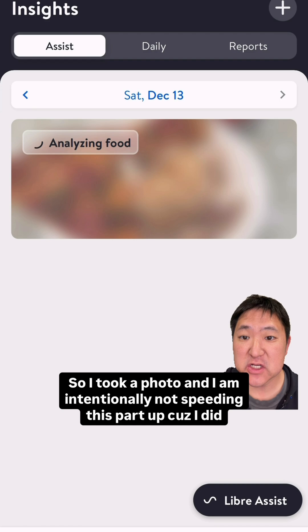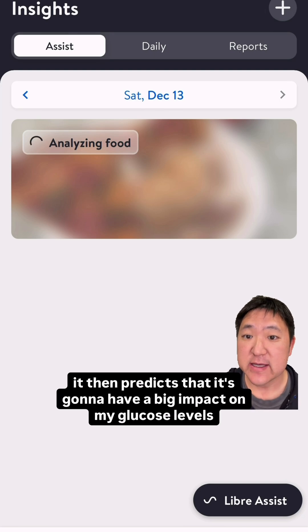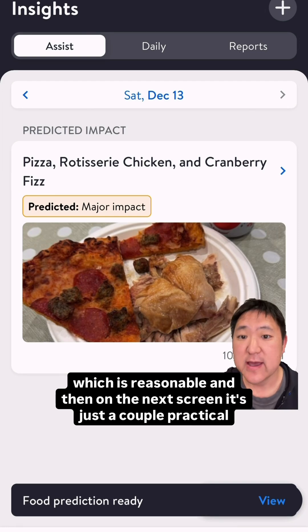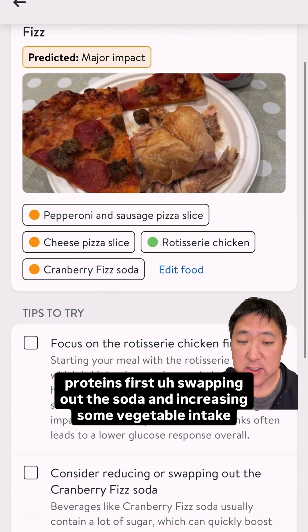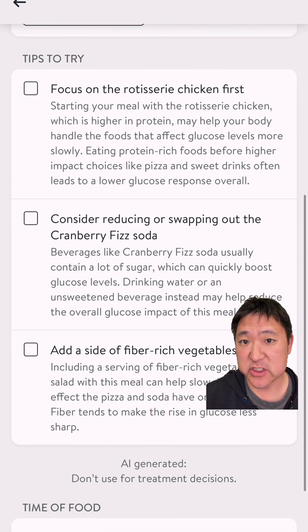I took a photo and I'm intentionally not speeding this part up because it did take a little bit longer than I would have liked. But as you'll see, it then predicts that it's going to have a big impact on my glucose levels, which is reasonable. On the next screen, it suggests a couple of practical tips to reduce the glucose spike, such as eating your proteins first, swapping out the soda, and increasing vegetable intake — all reasonable suggestions.